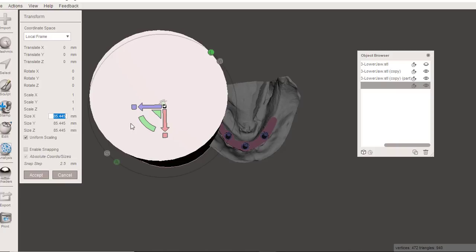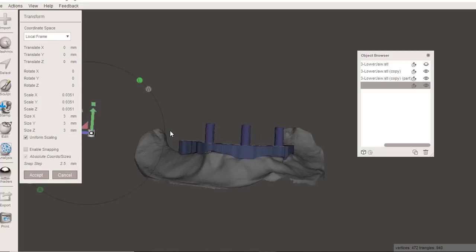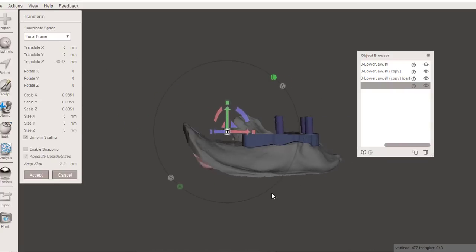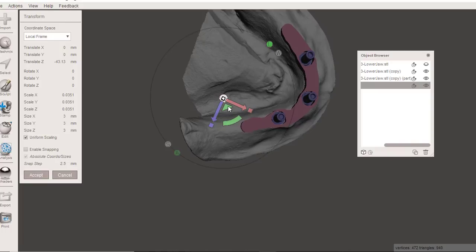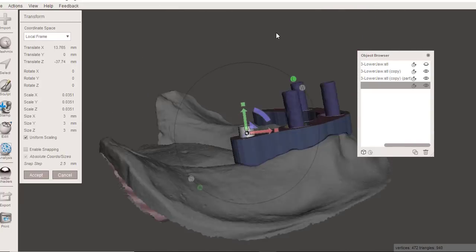If I wanted a cylinder that is, let's say, 0.5 millimeter bigger than that, so let's make it 3 millimeters, then I could just type in here with uniform scaling turned on, 3 millimeters. And now you see that I get this tiny little cylinder, which I can then pull over and position. And what's going to happen is that I'm going to end up subtracting out a little portion for that locator bar to sit inside of this.